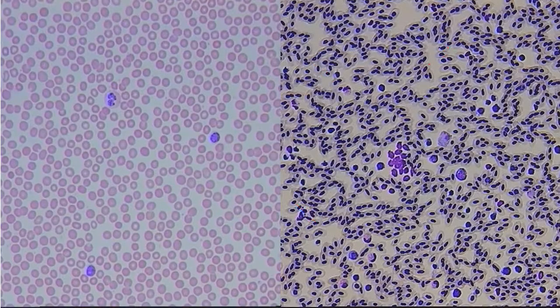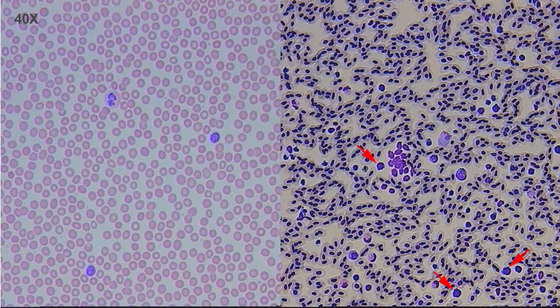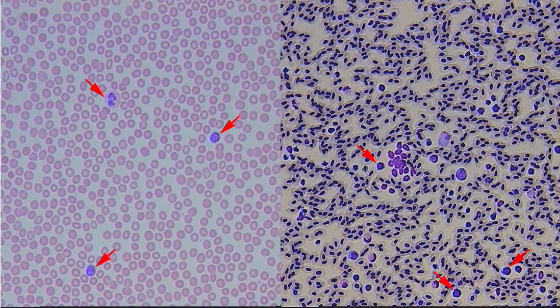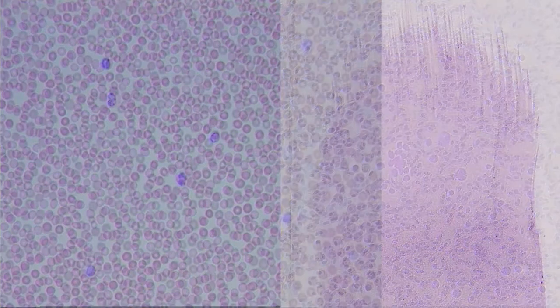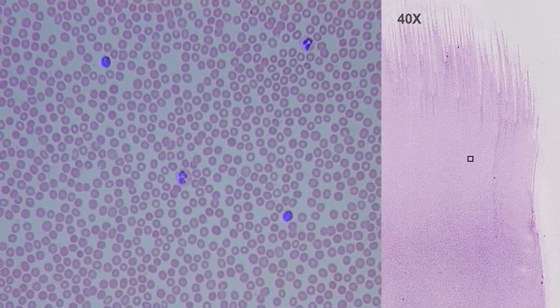At a higher magnification, the erythrocyte morphology is clearly seen. White blood cells, also called leukocytes, are shown. They are the cells of the immune system that are involved in protecting the body against both infectious disease and foreign invaders.